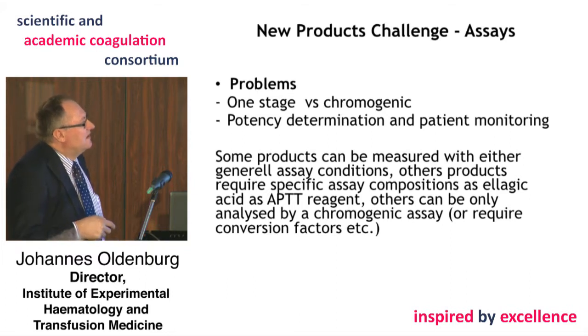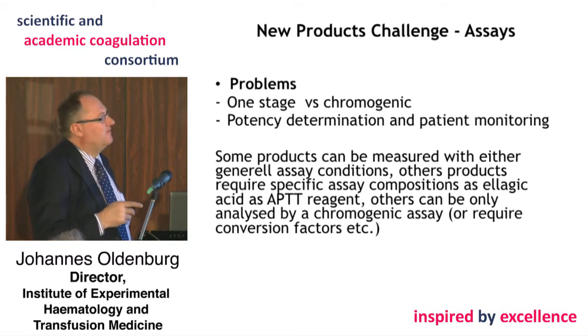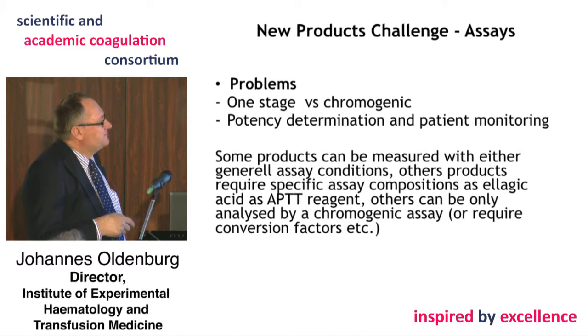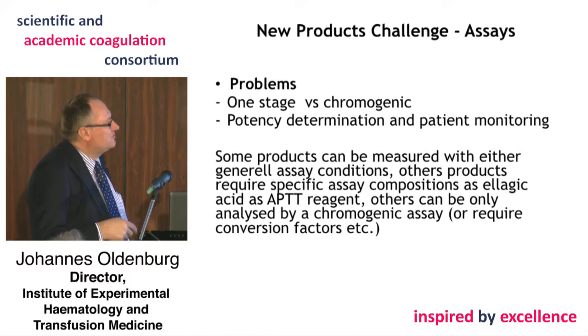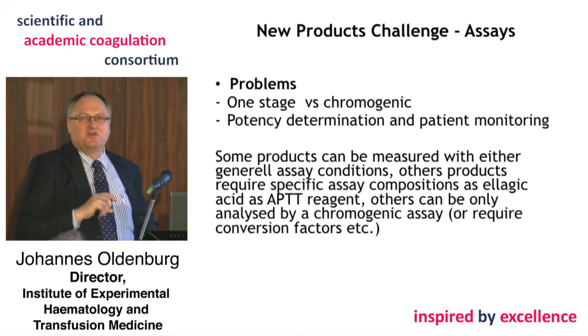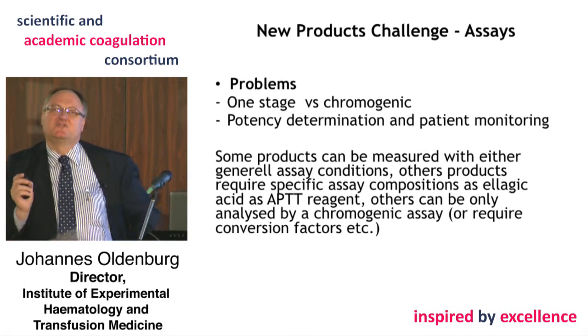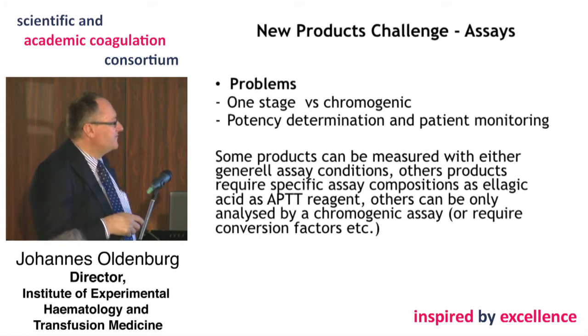So with respect to the new products, we again have several challenges between the one-stage and the chromogenic assays, and also with respect to the potency determination. For all these new products in Europe, the potency is determined with a chromogenic assay.